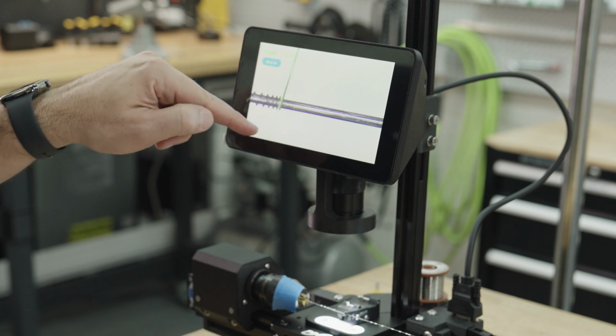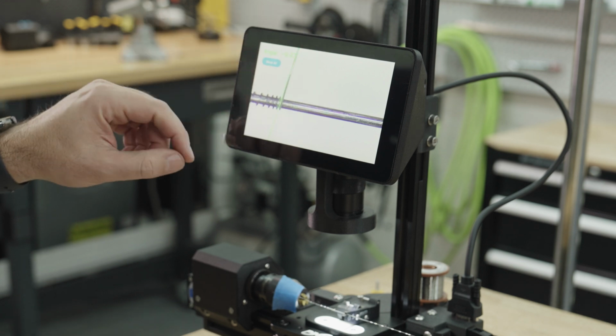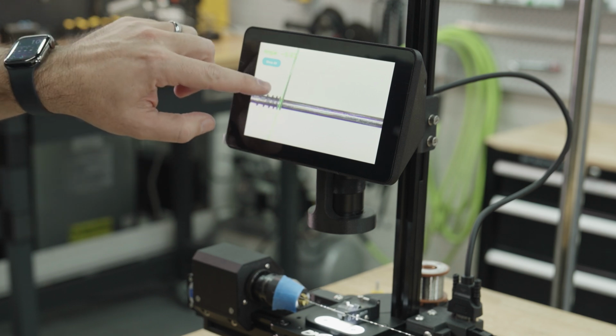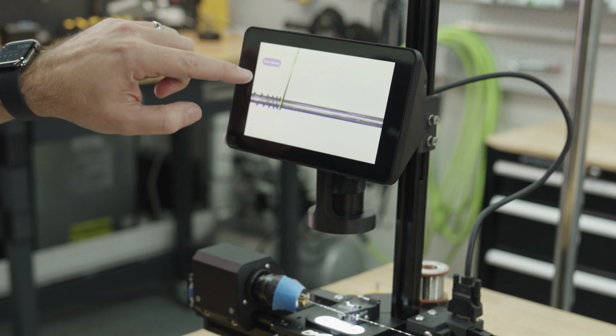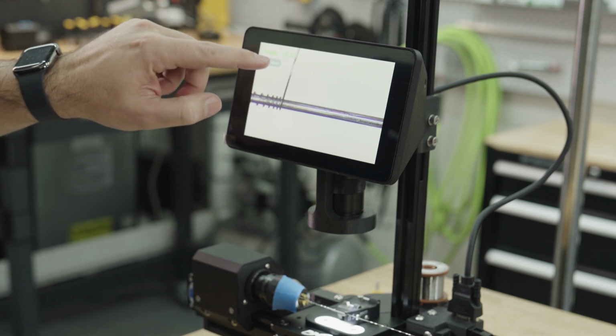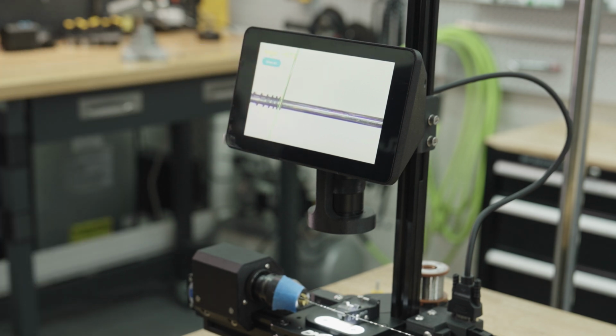Green lines means many edges have been detected. Yellow is fewer and red is critical. You can turn off the lines by pressing Show All, Show Median, or Show None. We'll leave them on for now.